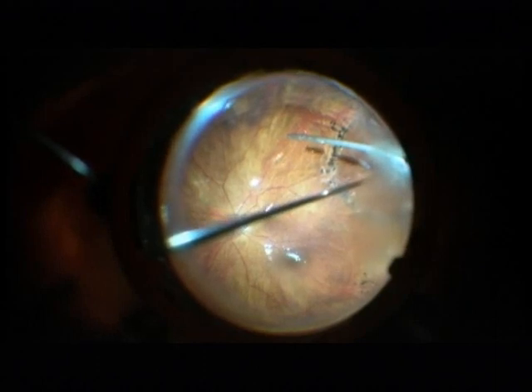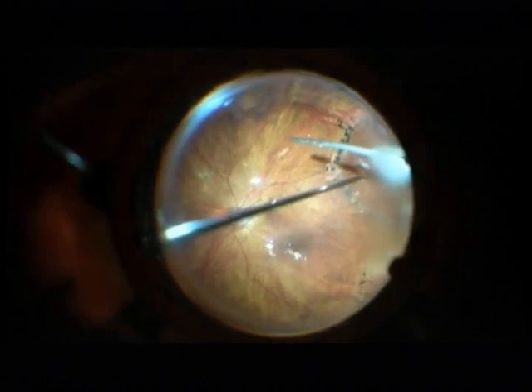I am adding now perfluorocarbon in order to flatten the edges of the hole to the retina, so that I can perform a nice laser coagulation. You see that the edges of the hole have never been laser treated before. Here is the second tear, which is laser treated just now.